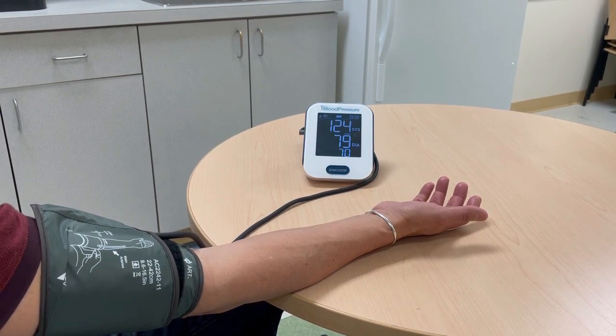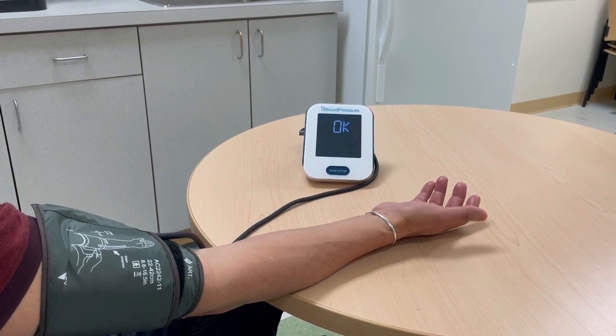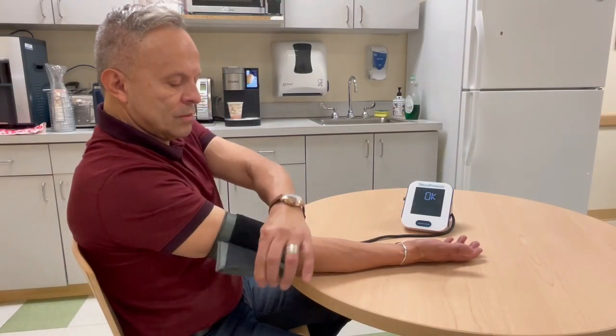Your medical provider will tell you what your goal blood pressure should be. You do not need to record your blood pressure readings. This blood pressure device communicates your results to your provider, and therefore it is important that only you use this device. You should not share it. Take off the cuff and store it for your next use.